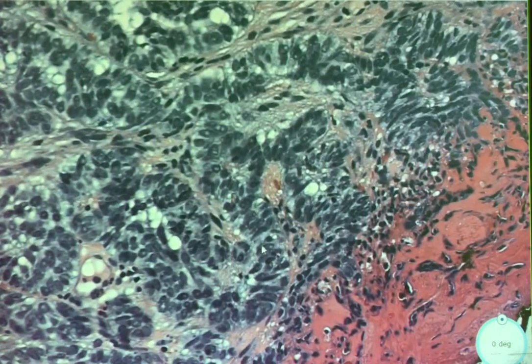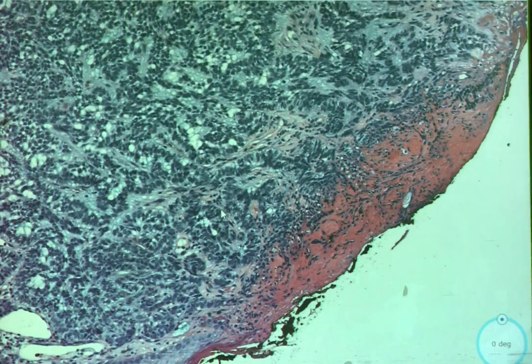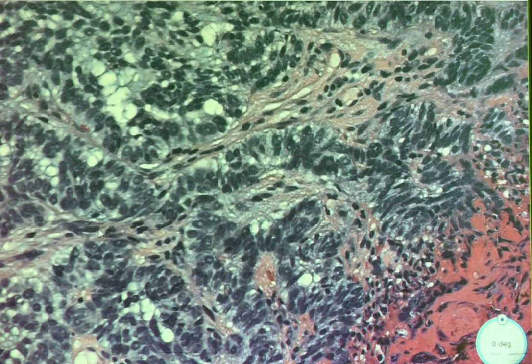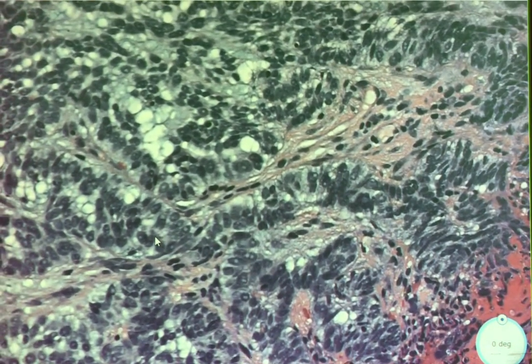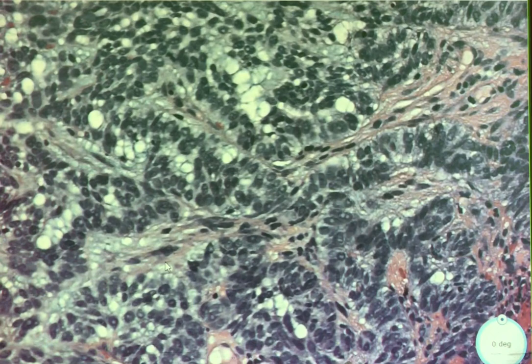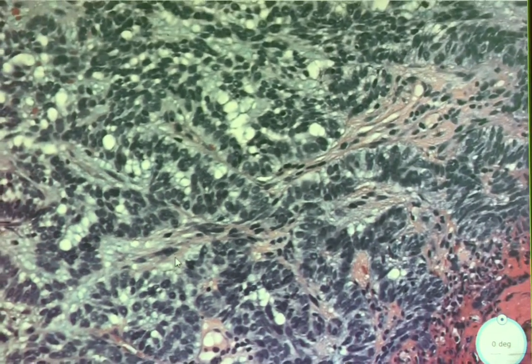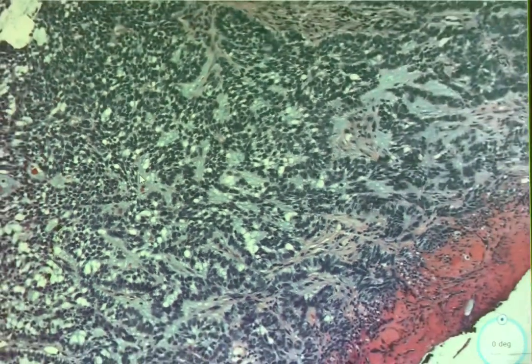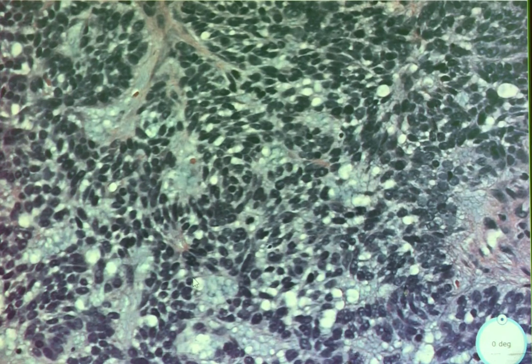Okay. So for this, I would say this kind of has more of like a corded appearance. So you can see almost where it's like two lines kind of going through, but they're weaving in and out, and it's really hard to tell what's going on. And hyperchromatic? Very. There's some vacuoles. And do we see any more of that sort of myxoid stuff? That sort of blue-gray stuff? Yeah, we see it in between. So the cells don't look normal. There's a lot of them, right? Yeah, a lot of them.